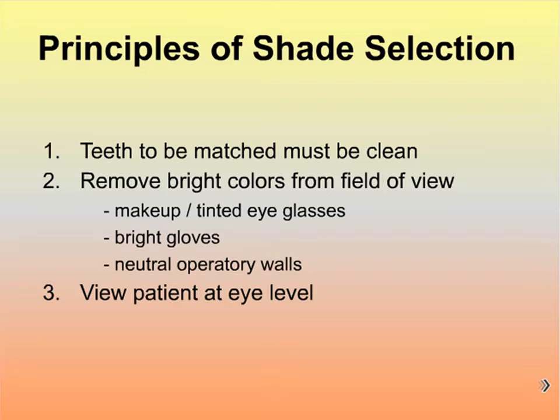Makeup, clothes, lipsticks, bright gloves or tinted gloves used, and the walls of the operatory. All these must be covered and neutralized. To look at a shade guide, you have to look from the patient's eye level.